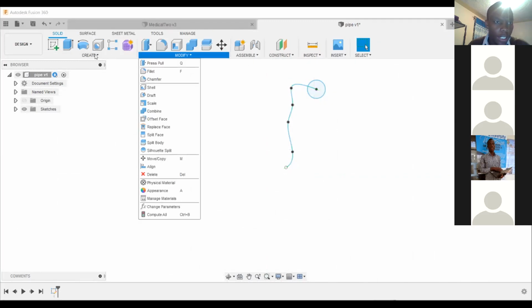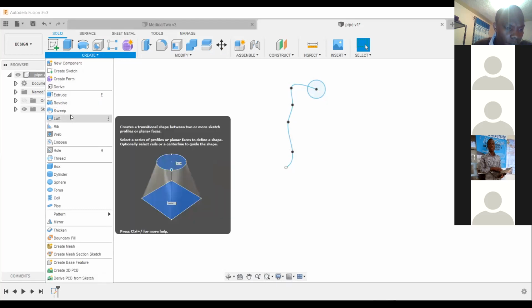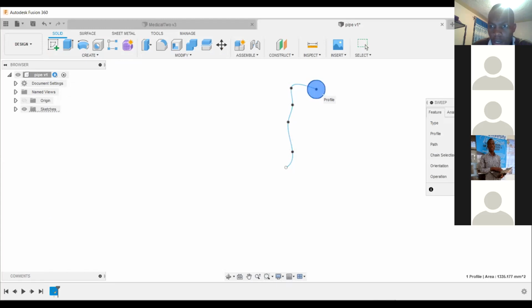Then here under create, what I wanted to share with you is what is called sweep. So you do sweep, then select path.